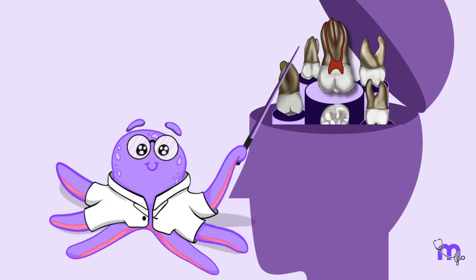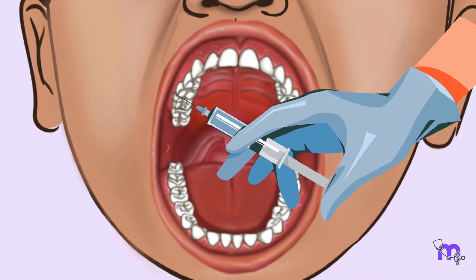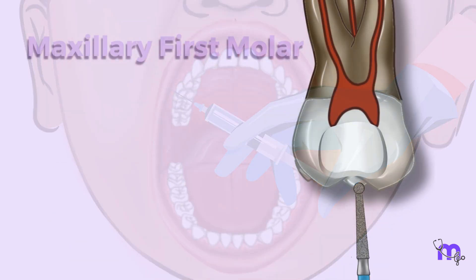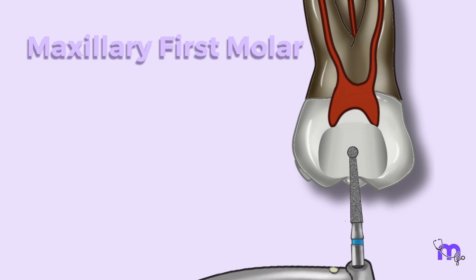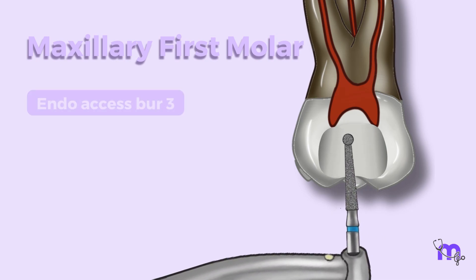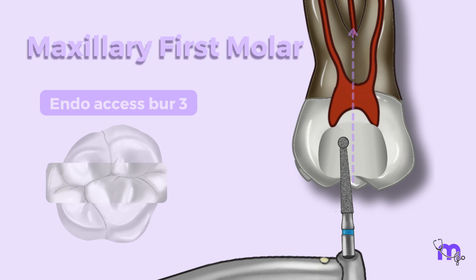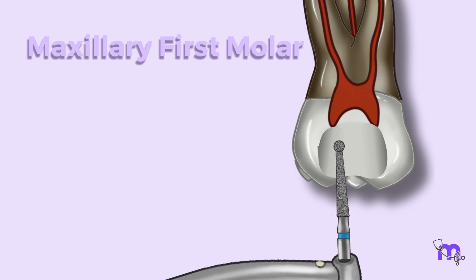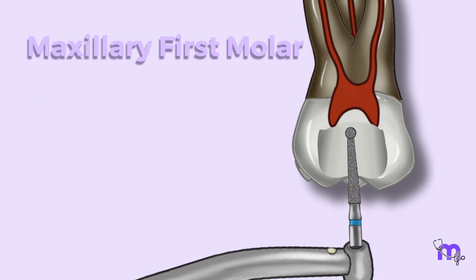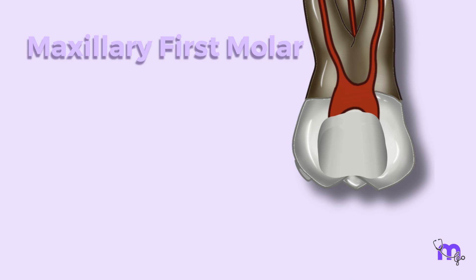Keeping this anatomy in mind, I began the access opening after injecting local anesthesia. I removed the enamel and the previously placed restorative material with an endo-access bur in the central fossa, angling it towards the palatal root. After this, I continued to go deeper and simultaneously enlarged the cavity to feel the drop.